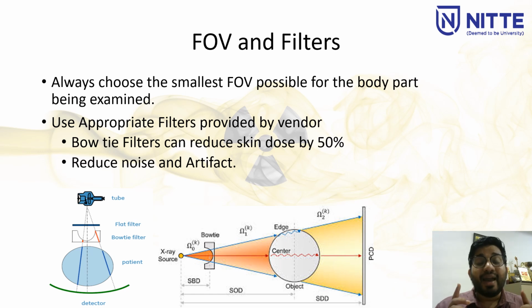In accident and trauma cases, if required, you may want brain as well as orbit, paranasal sinus, facial bone, everything done. So you keep a bigger FOV to cover the entire brain and face, then keep smaller display fields of view to acquire all the organs or parts to be imaged. So you don't need to expose the patient multiple times. You will have only one exposure and you will get the other reconstructed images.